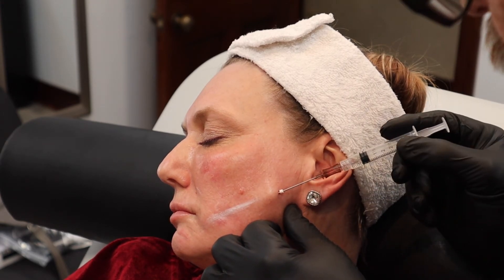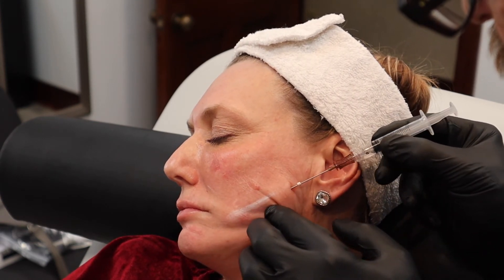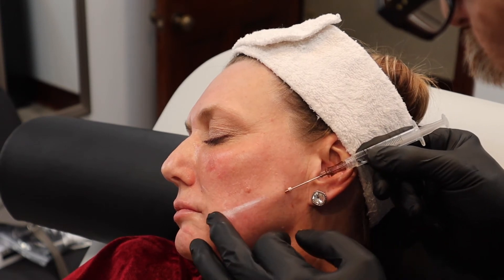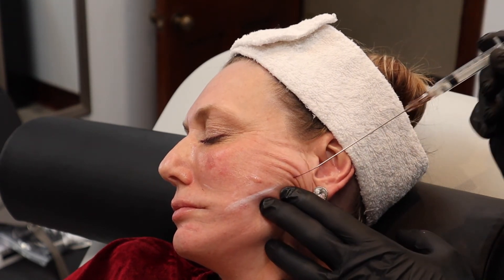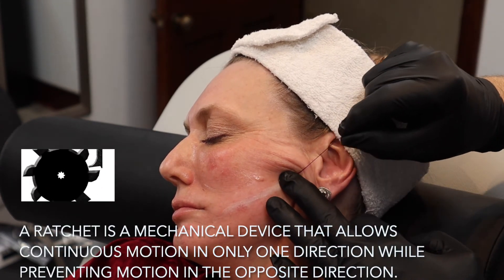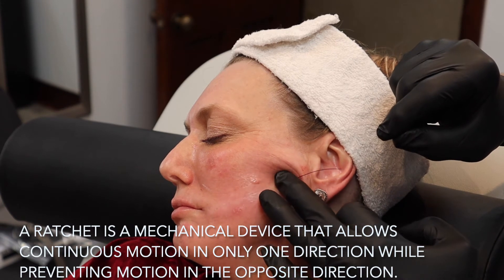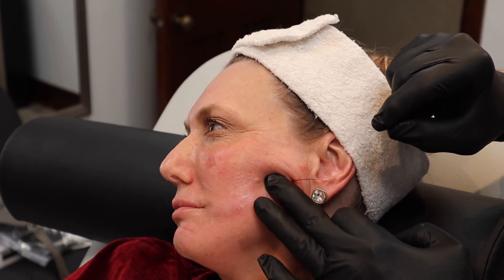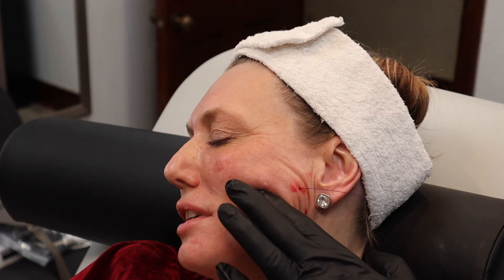We do the same thing on the left side and I add a little bit of lidocaine as I go. It's no worse than having fillers done — maybe even a little milder. There seems to be less bruising, and you don't have to worry about injecting into an artery causing an embolism. Again, you can feel that ratchet up as you tighten the thread. It provides some immediate lift, but there'll continue to be more lift over the next few weeks as it starts to heal and form new collagen. I like to pull up on these to get maximum lift at the time of the procedure, and they'll continue to ratchet up a little bit over the next couple of days.